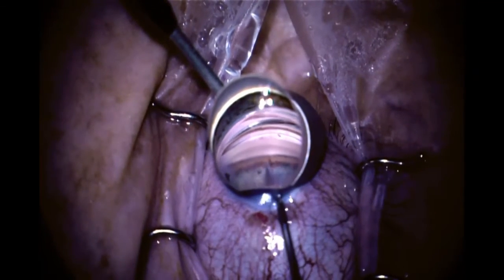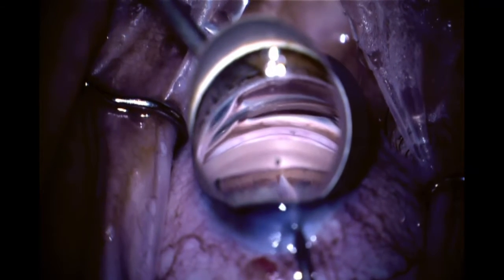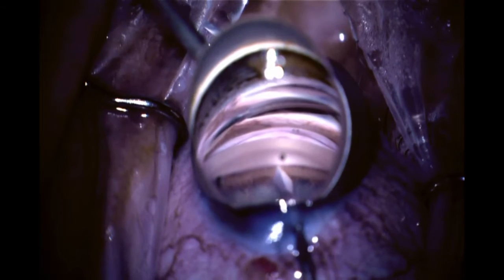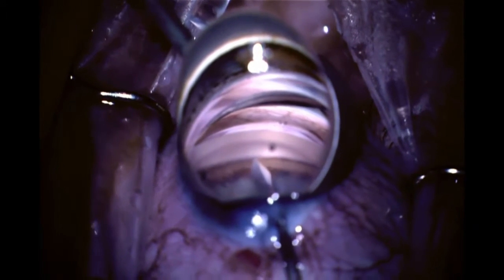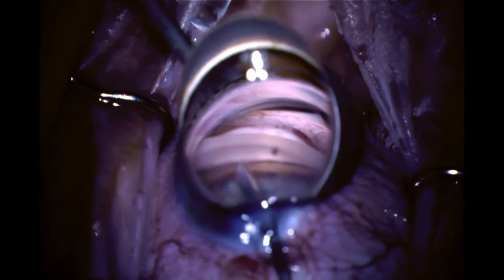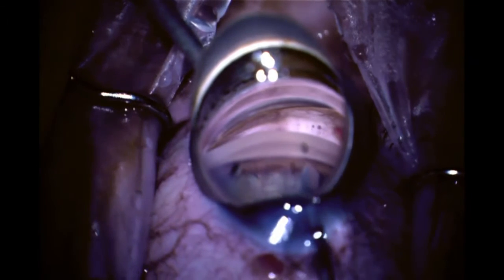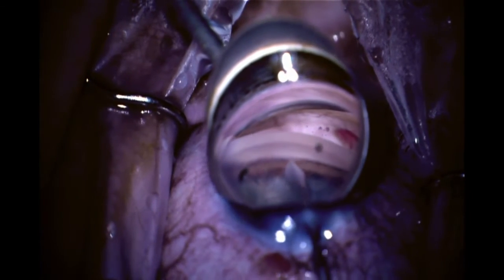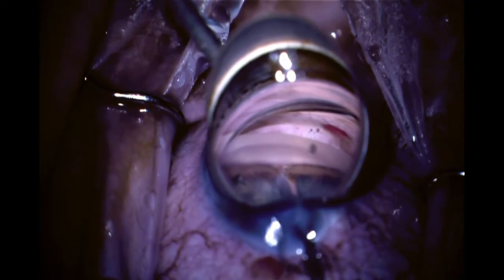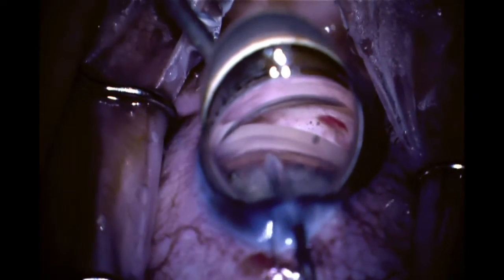I begin to create a 1 to 2 clock hour goniotomy nasally. When performing this step, it's almost all by visual cues — there's very little tissue feedback. In fact, if you're getting a lot of feedback or resistance, it indicates that you're likely too deep and hitting the posterior wall of Schlemm's canal, which of course is sclera. Once I create the goniotomy, I like to very gently press on the inferior lip of Schlemm's canal to ensure it is open.